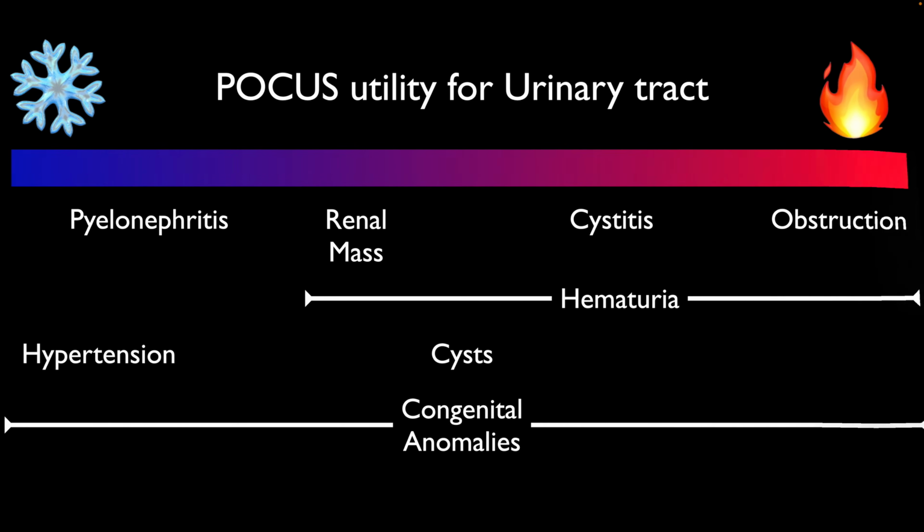When we talk about using clinical ultrasound or bedside ultrasound in the evaluation of the urinary tract, we have to keep in mind what utility it has. For me, when I think about it, I think along these lines. Those that are cold are those topics for which it's less useful, whereas those that are hot, I find it more useful. Now, there is some overlap.